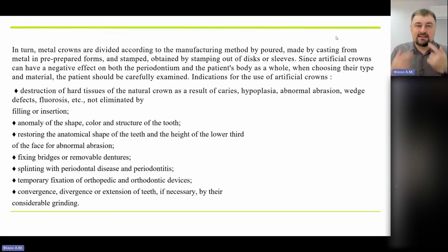That's why you can see aesthetic problems like this, with skin folds on the patient here. How to treat the situation? What is the treatment? Treatment, of course, is prosthetics on the implants. Yes, to place implants and to make crowns and bridges later on them.